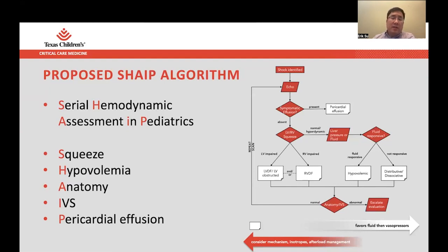But one of the first things to check out, particularly if you work in a cardiac ICU, is whether or not there's a pericardial effusion. Going through the flow chart over here to the right, the idea is first to put in your workflow: am I going to get cardiac imaging done while I'm trying to stabilize this patient? With a quick subcostal sweep, you can look for an effusion. You put the probe in the position right below the xiphoid process, pan up and down, look for any kind of irregularity to the effusion, and see if you have to work that up.